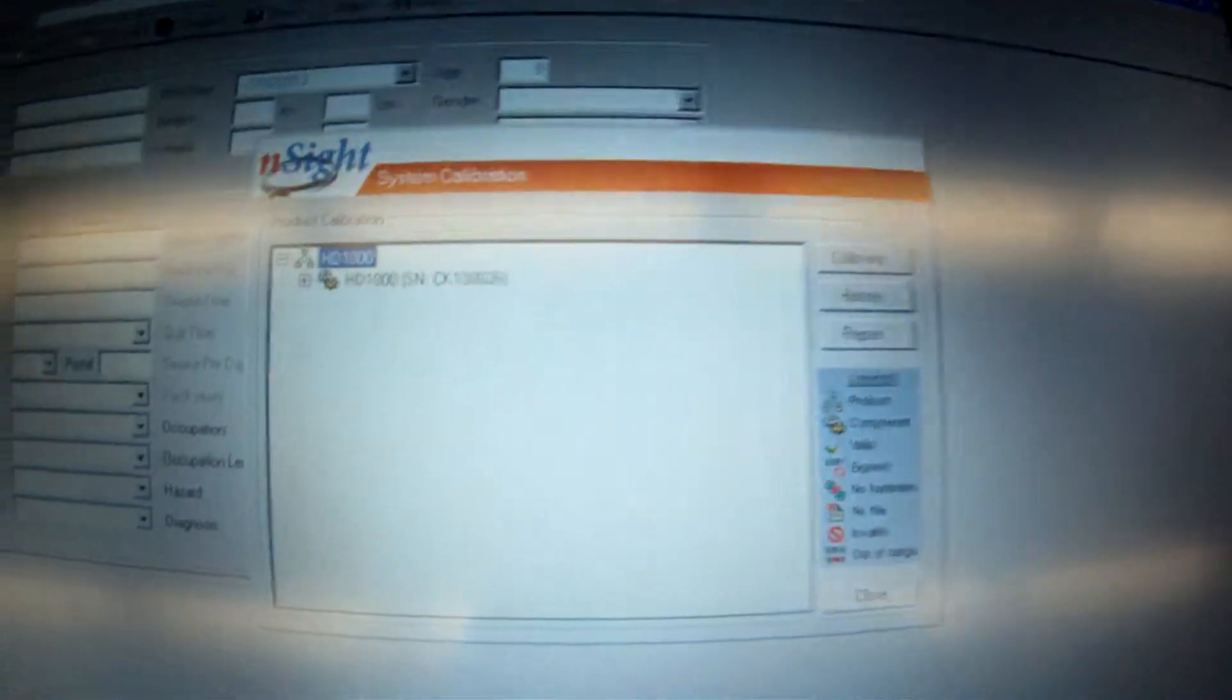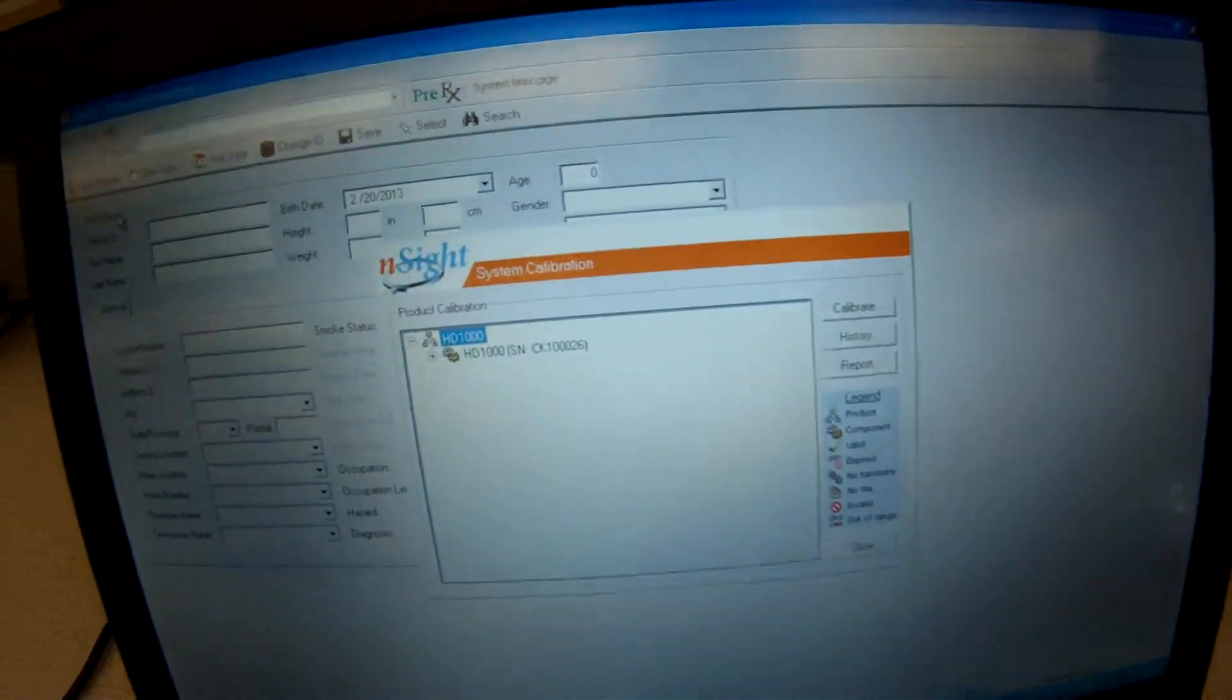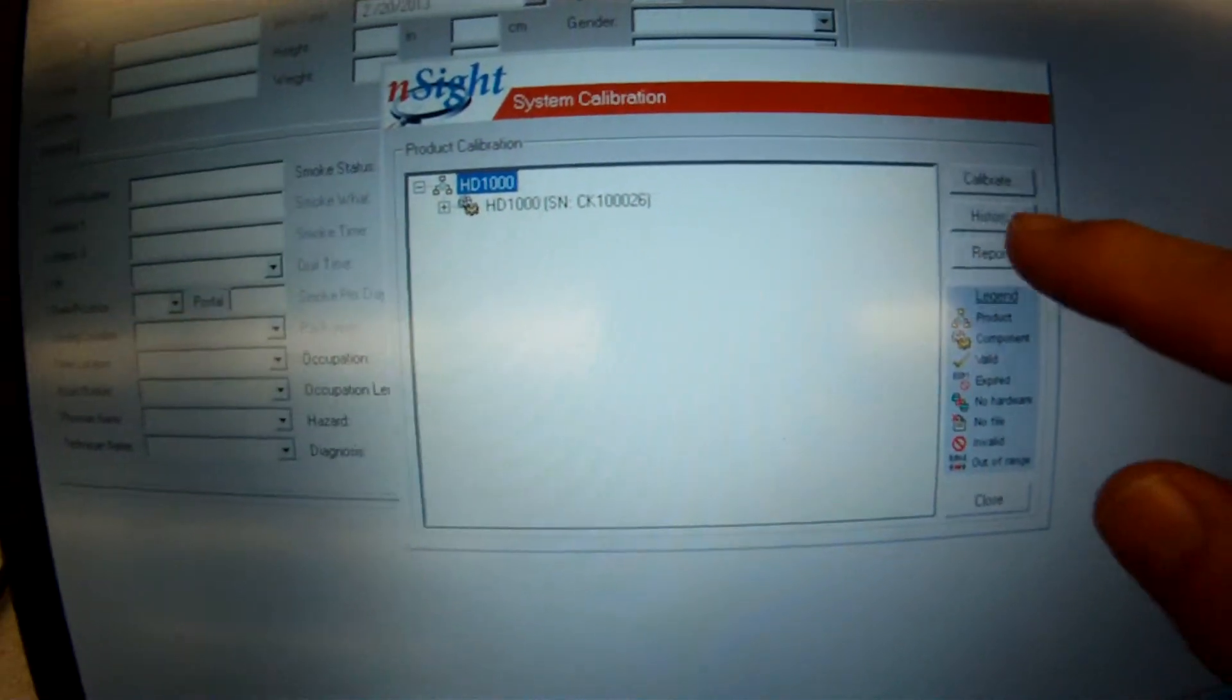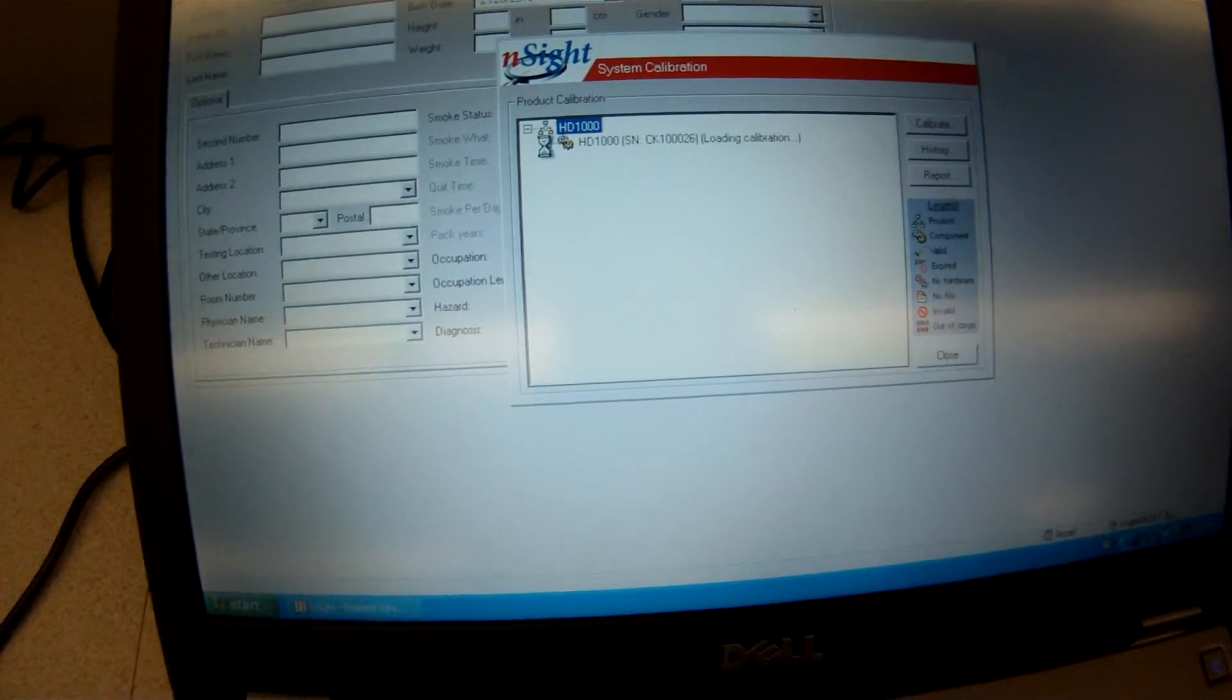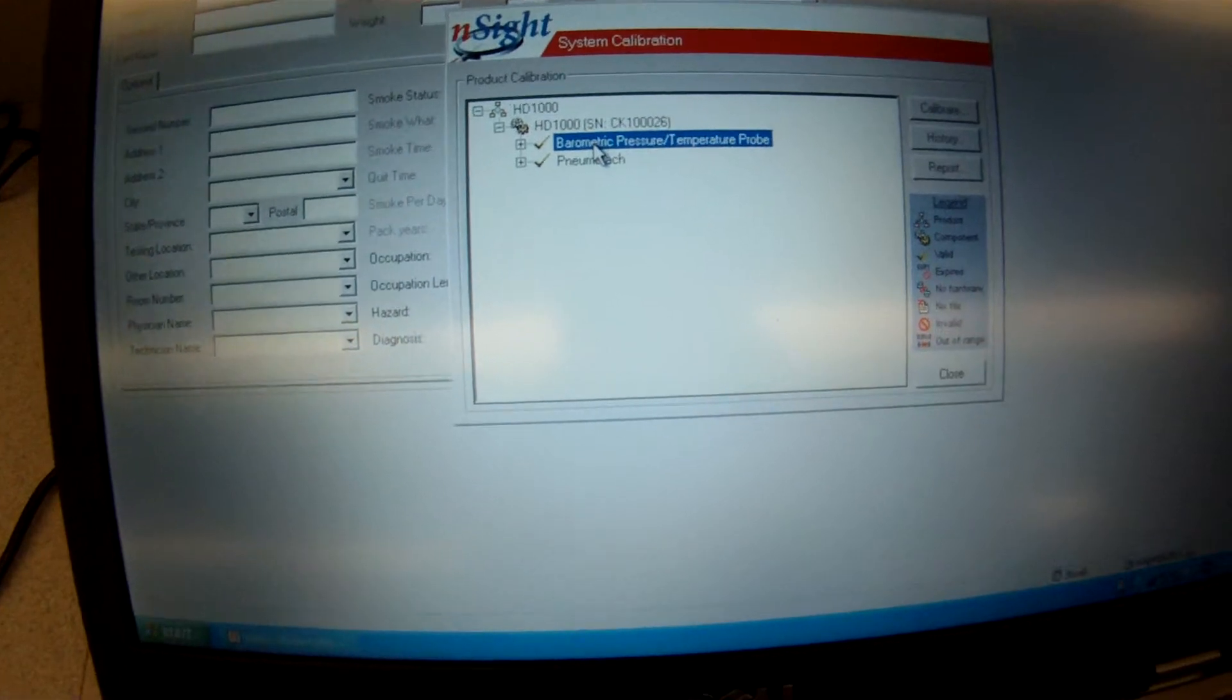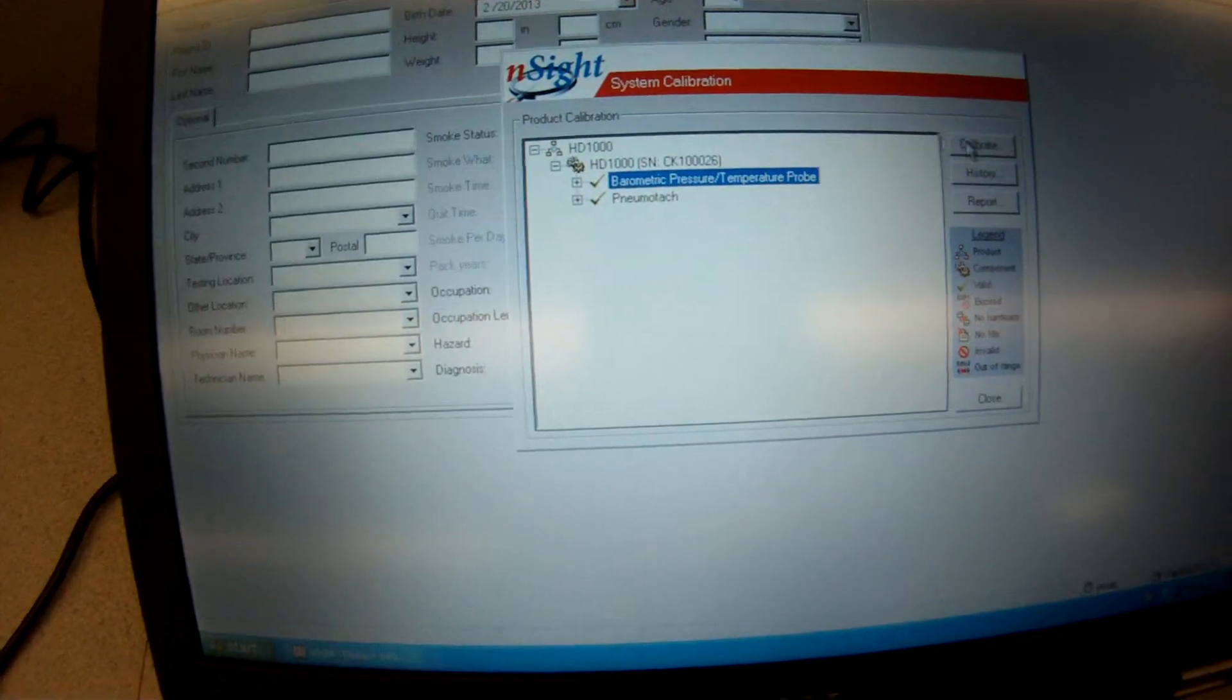Once we get the calibration going here, I know there's a little reflection on the screen there. There's nothing I can do about that right now. So we're going to calibrate, but we're going to first start off here by entering the barometric pressure and temperature. So click on that, hit calibrate.